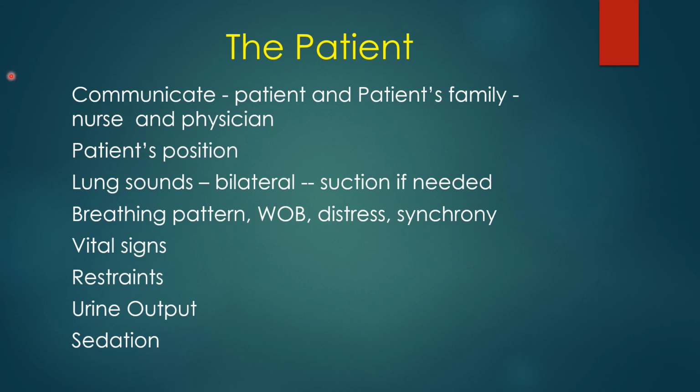You want to check the patient's restraints. Their hands should be tied down. You don't want it loose enough so he can reach up and get his ET tube. And if you have to do something with the patient where you undo his restraints, you want to make sure you tie him back up. I mean, you might be doing chest physiotherapy on the patient and have to untie one hand to turn him over on his side, and you must not forget to tie him back down. If he self-extubates, that would be your fault.